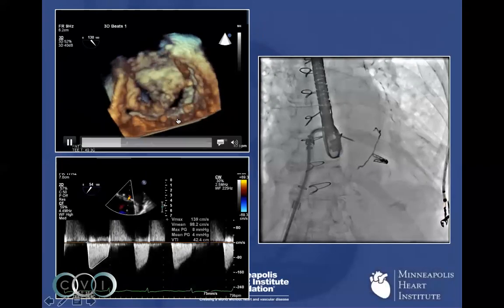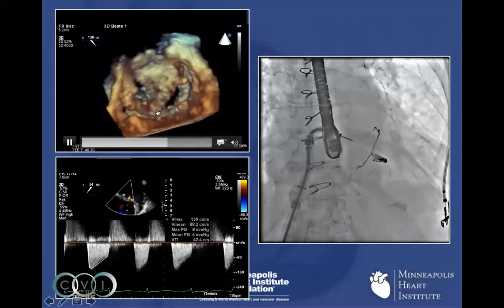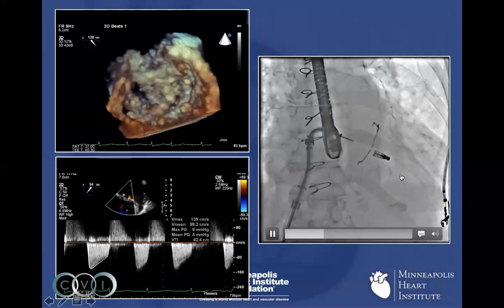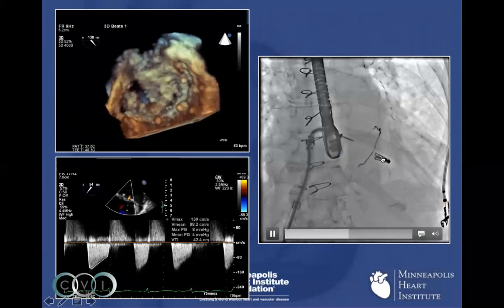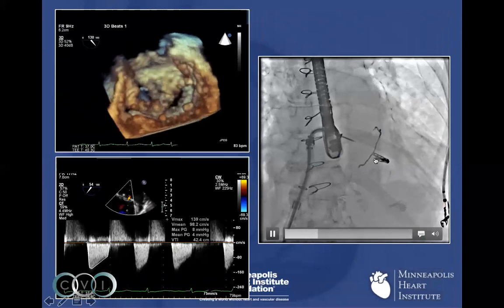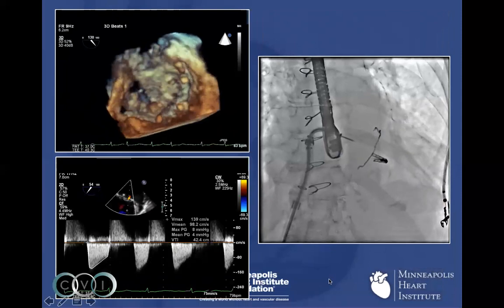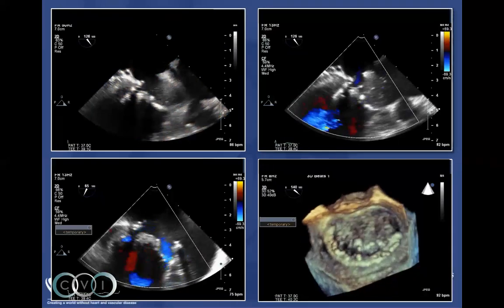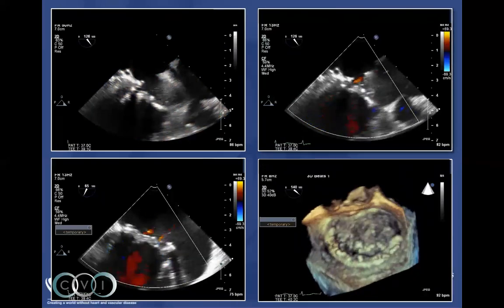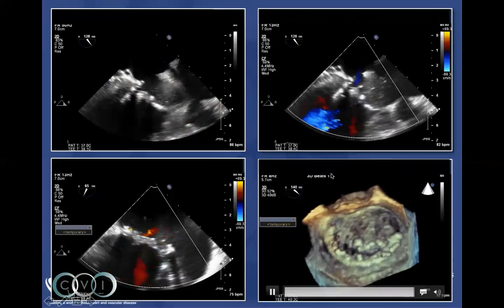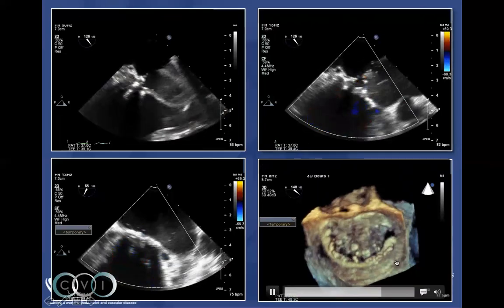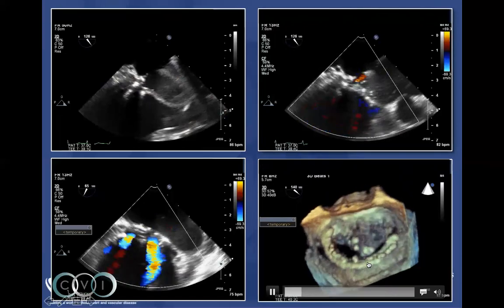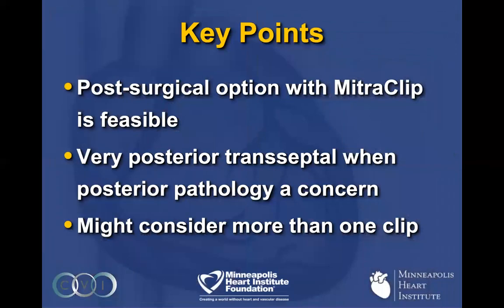This is what it looks like: the anterior leaflet is essentially stapled to the annuloplasty ring. The gradient remains insignificant — only four. Here's a nice fluoroscopic view showing the clip essentially stapled to whatever tissue there is in the posterior annulus as well as that annuloplasty area. Here's the final view with the clip released — it's actually quite satisfying. The clip is nice and stable, there's no residual MR, and this is a 3D view showing a different kind of tissue bridge where the anterior leaflet is connected down below.